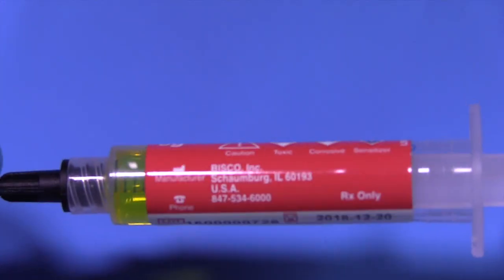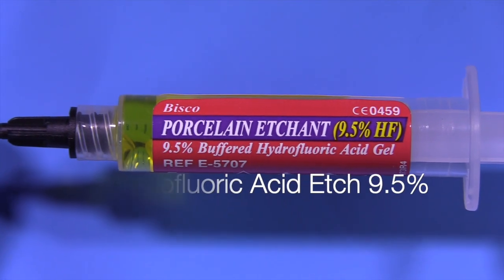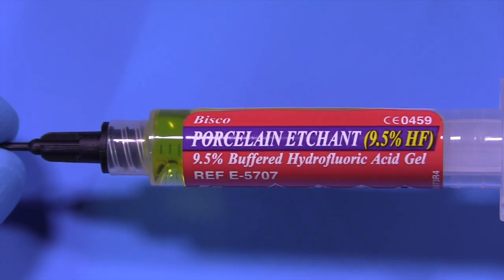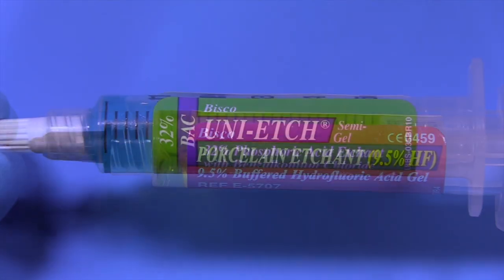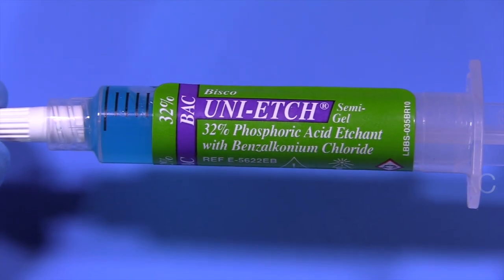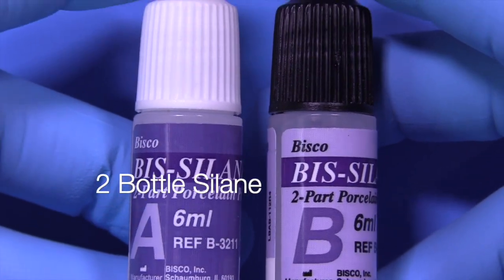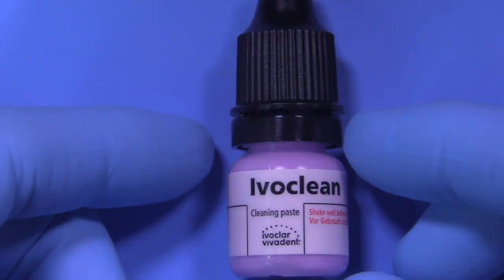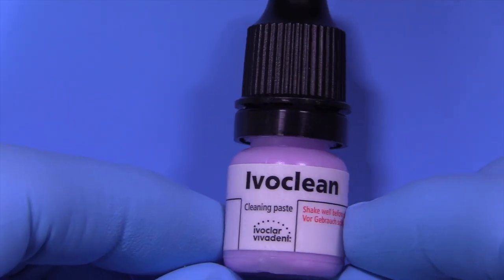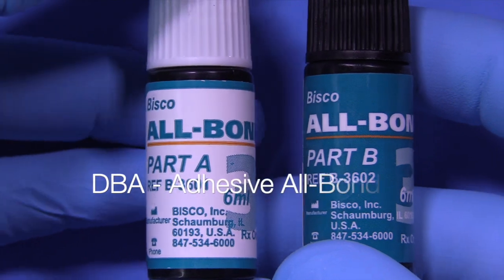Let's talk about the etching procedure and the materials I like to use. This is hydrofluoric acid at 9.5% — we can use 5% or 4.5% — and with lithium disilicate the etch time is 20 seconds regardless of the strength. This is phosphoric acid 32% with benzalkonium chloride, which helps to kill bacteria. I like to use a two-bottle silane system, though there are great one-bottle systems too. Also IvoClean, a cleaning paste, and then whatever bonding system you like.